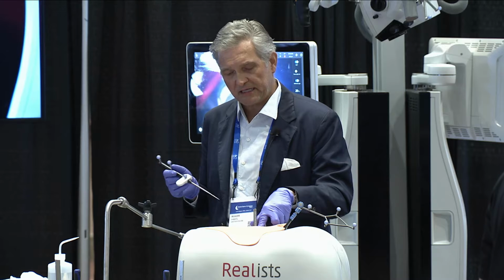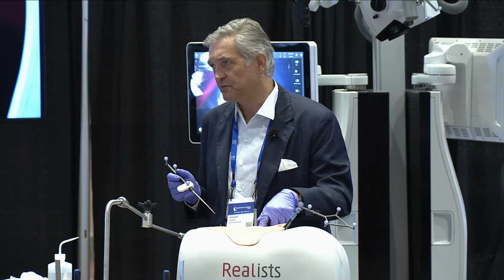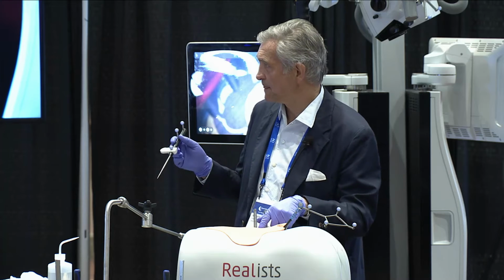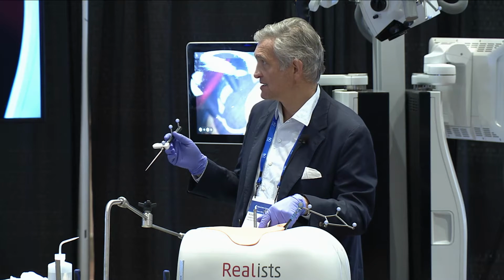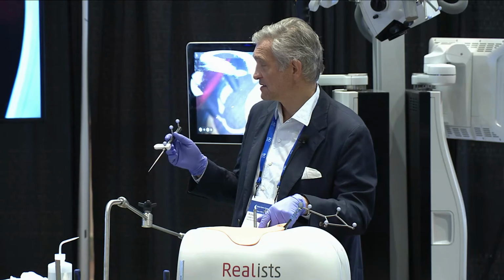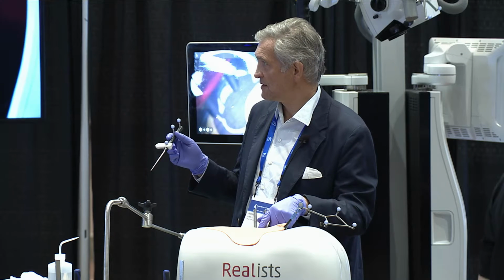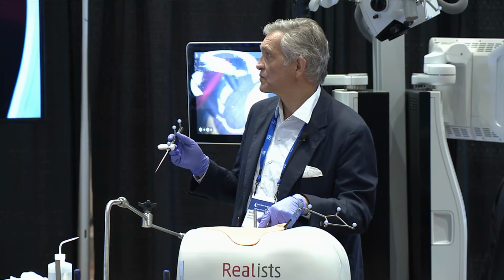It seems the screws are never really in the way with the tube. You know, that's the other thing. So I've never seen that being a problem. Do you think, Dr. Harter, that using navigation to insert the screws helps you to have the screws in a better position so they do not get in your way when you are decompressing?